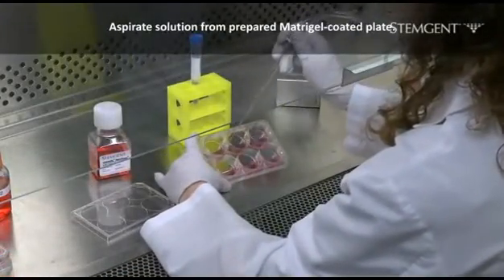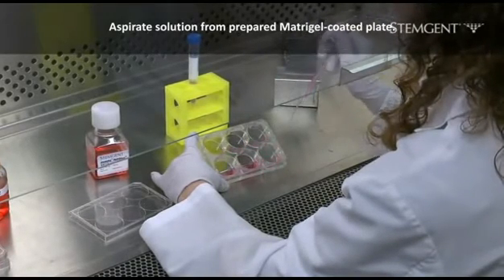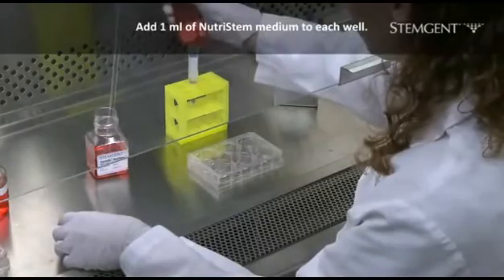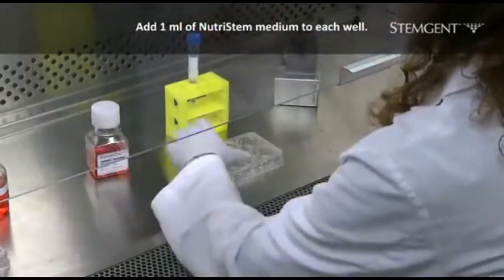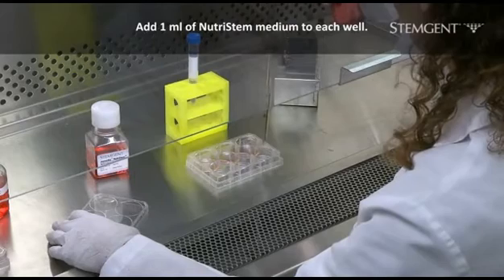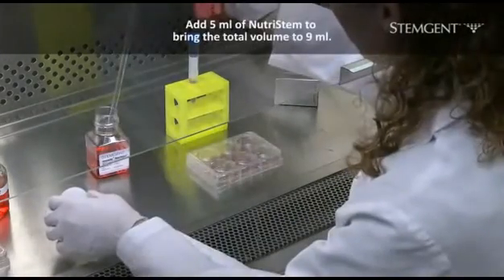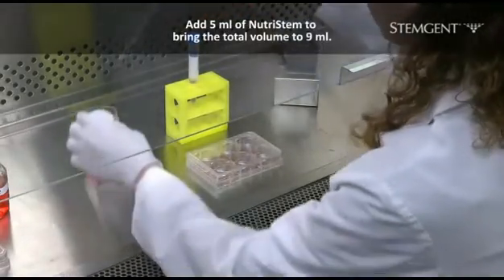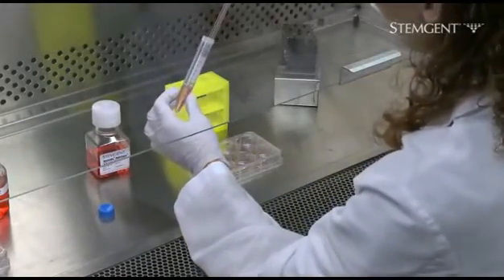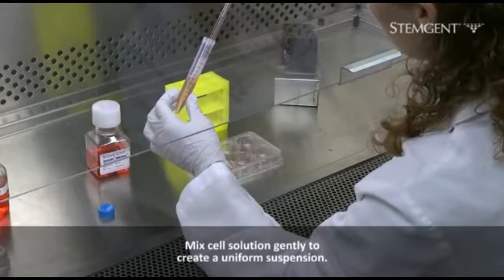Aspirate the solution from the prepared Matrigel coated plate. Add 1 milliliter of NutriStem medium to each well of the plate. Add 5 milliliters of NutriStem to the tube to bring the volume of the cell suspension to 9 milliliters. Mix the cell solution gently in order to create a uniform suspension.